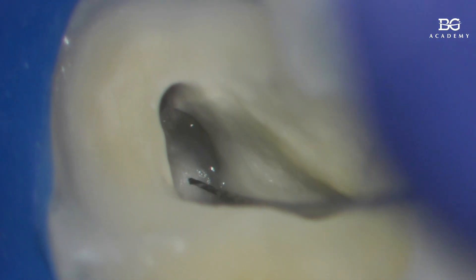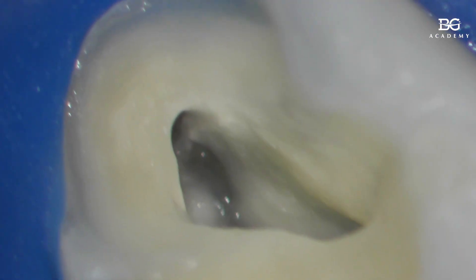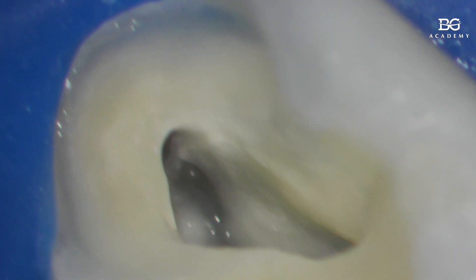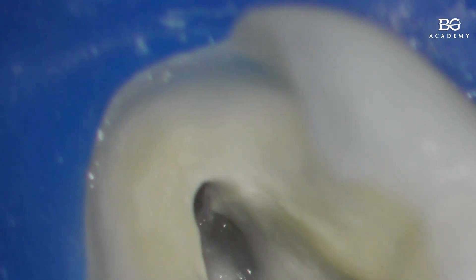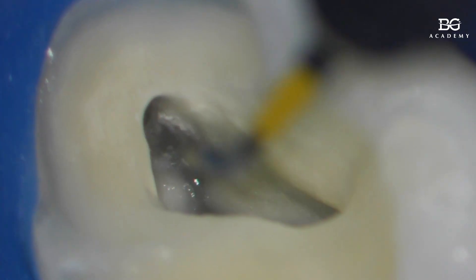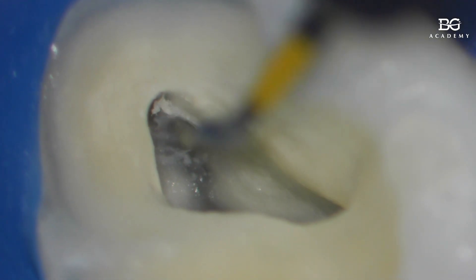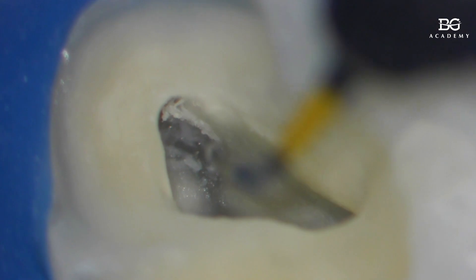Here's the orifice — it got stuck against the wall of the orifice. Of course I could force the file through, twist it or something, but that would just create a ledge. All of this needs to be removed. This can be removed using ultrasound or with very thin special endodontic burrs — those thin elongated ones on a long shank — to remove these overhangs. Or you can use ultrasound.